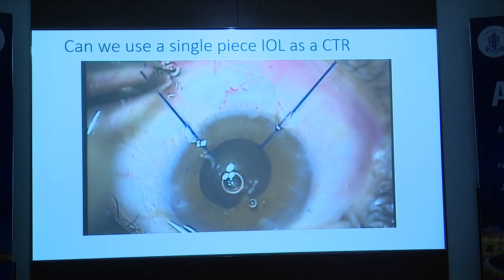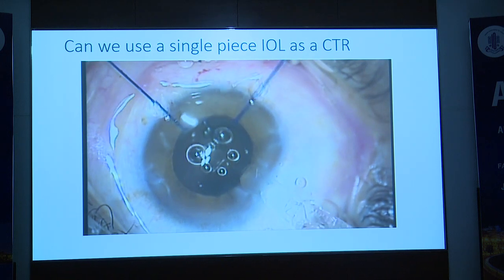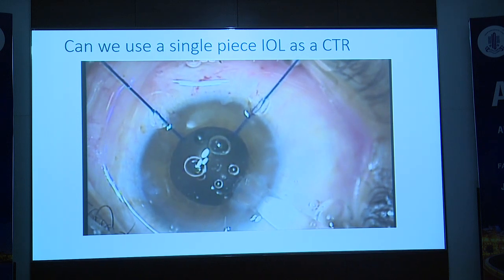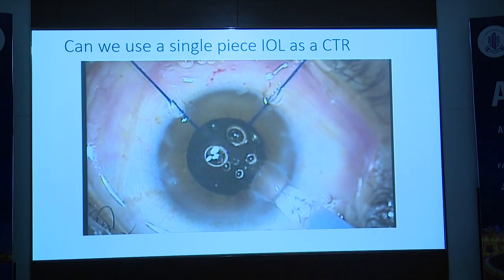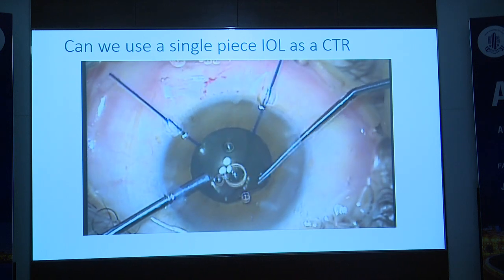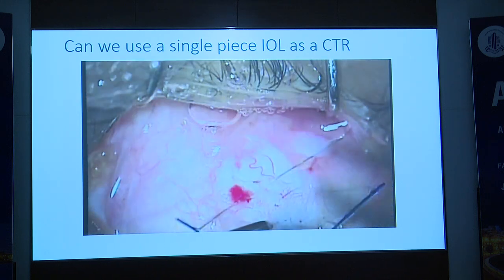Yeah, there was no railroading, you're perfectly right. All these things are all after 2010. In those days, you just passed the suture anyhow. Inject the lens. Today we would do things a little bit differently to this. We'd probably railroad the suture out of the eye, but you can still use a single piece lens in this manner.